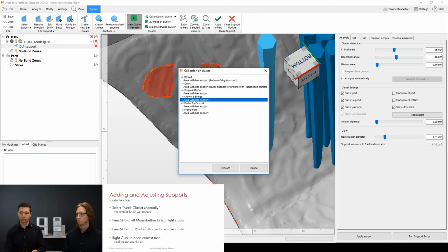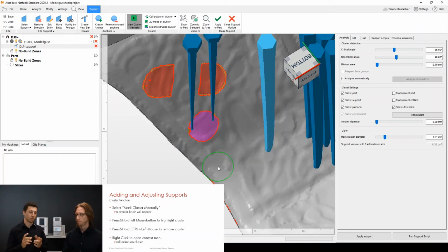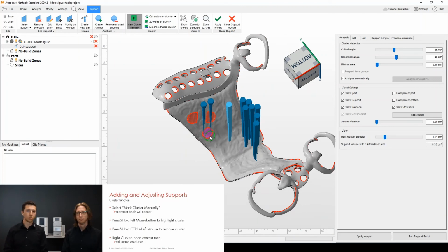So, but I can now select whatever I want, for example, the partial framework, standard one, and execute it. Of course, it's just a small cluster, so I can't see much supports right now, but it was just creating the supports according to the script we were using. And I think that's all we need to know for the manual cluster at the moment.